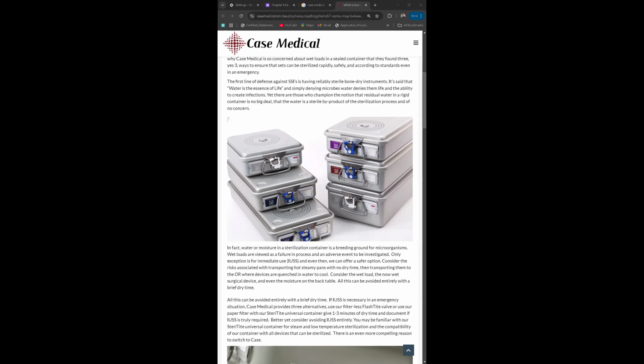So we put the locks there to tell us that whatever content is in there has not been touched by anybody, because for anybody to touch them, they will have to break the locks. So the basket, yes, is sterilized, but it is not sterilized just like a basket. It goes into something, and there are other requirements that it has to meet for it to be sterilized. I don't know whether I've explained myself enough for you to understand.